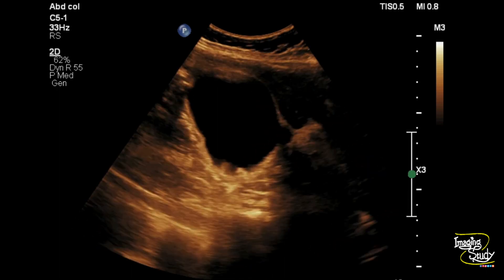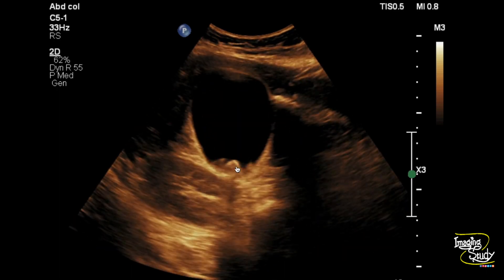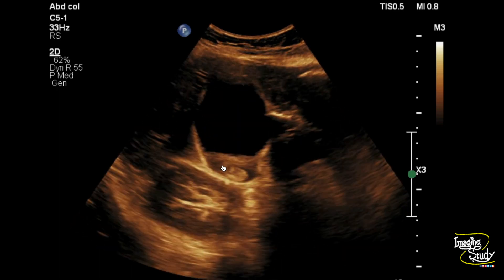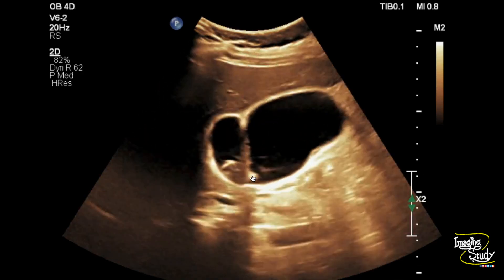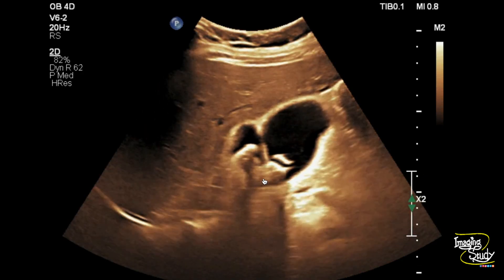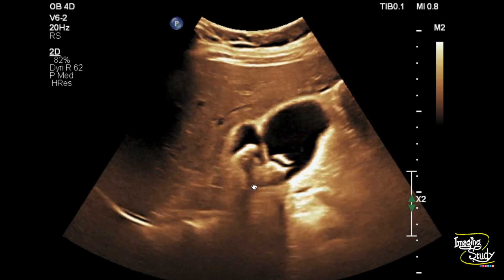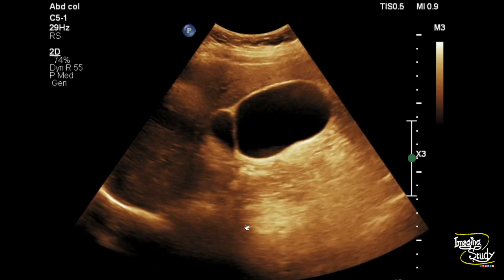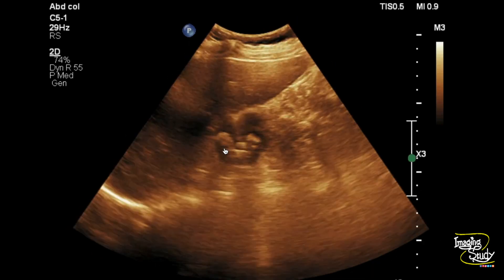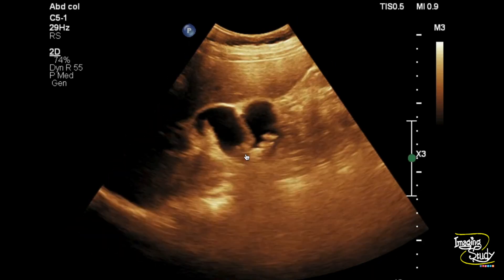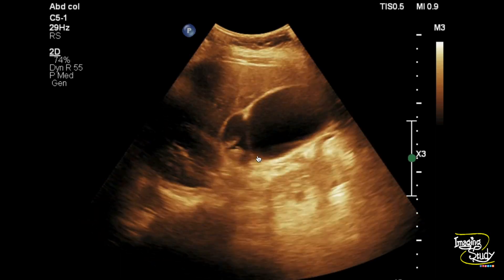Here you can see the longitudinal section of the gallbladder. You can see multiple bright echogenic structures of variable size seen within the gallbladder lumen, casting posterior acoustic shadows. Right now, due to gravity, they are within the posterior wall. These echogenic structures are nothing but the gallbladder calculi.